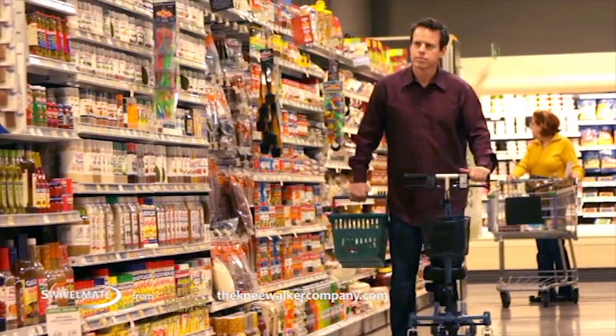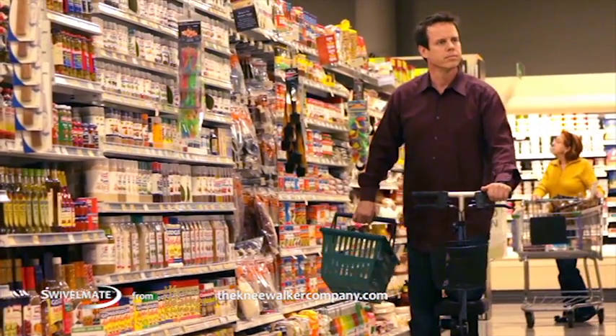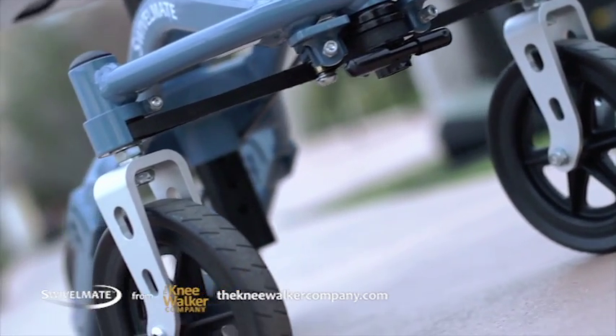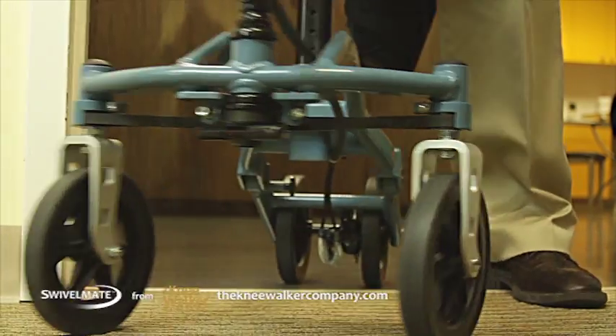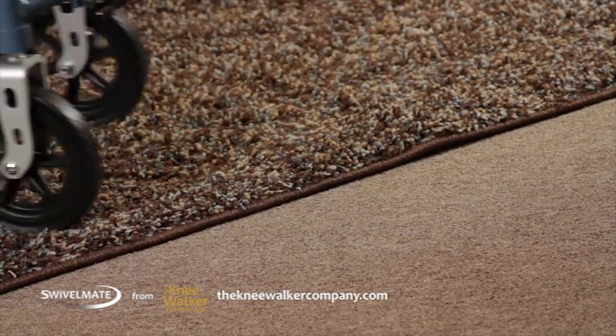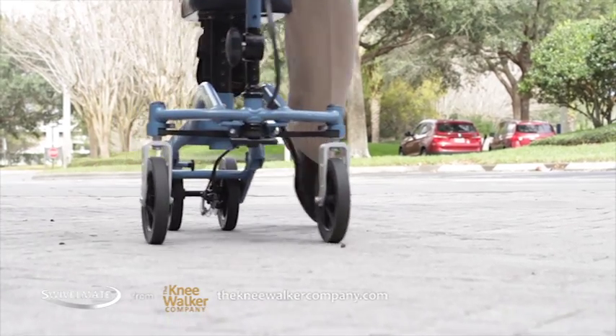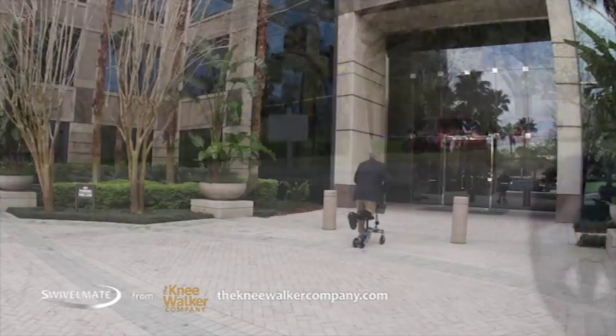Swivelmate also navigates narrow aisles so you can get errands done. You never have to worry about moving through different areas because Swivelmate moves smoothly on a variety of surfaces like tile, carpet, wood, and pavement quickly and safely.